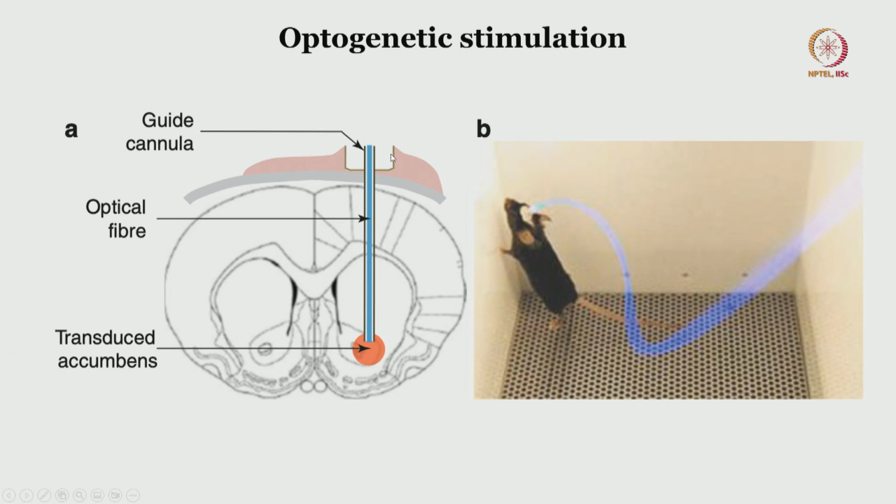So this is the cranial window that we have performed, and if you all recollect, a cranial window is performed and there is a PDMS sheet you can have, or you can have an artificial CSF, or you can have a permanent cranial frame which will hold the guide cannula, or for that matter you can fix it permanently using dental cement and leave the cannula in situ, which can be closed or open as and when you want to do the experiment using the optic fiber cable, which will pass through the cannula and stimulate that particular target.